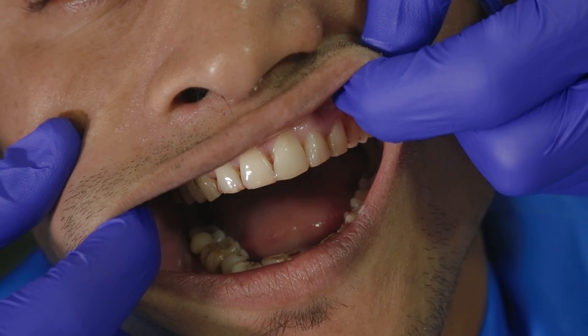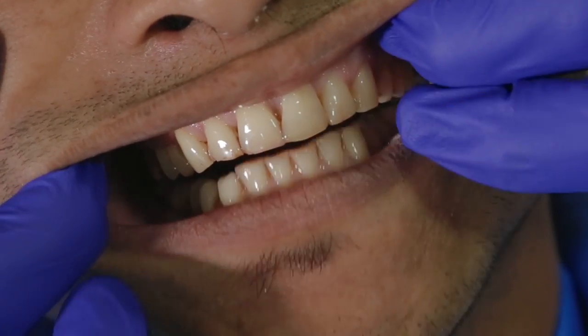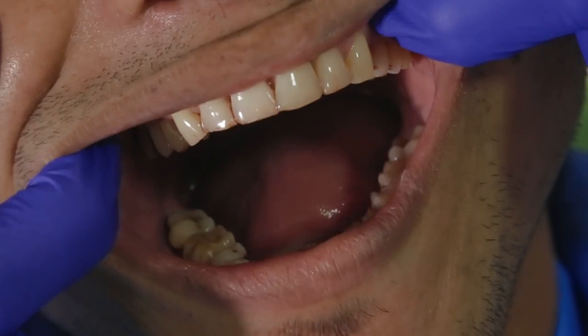Now, irrespective of what material we are using for the bite, it is very important to rehearse the closing position of the patient. This will help you record the bite without having to struggle to get the correct biting position.